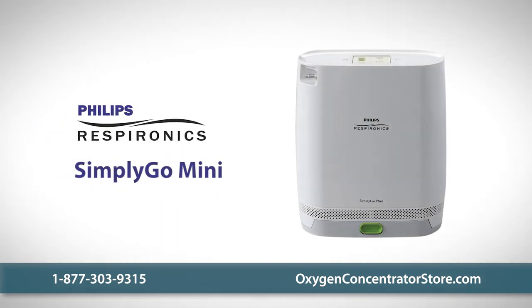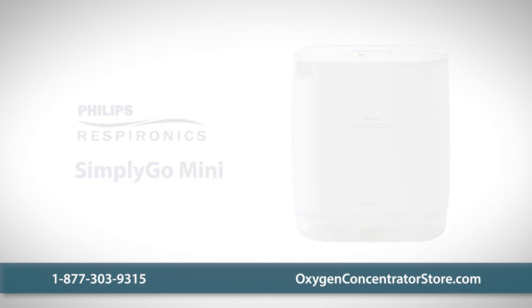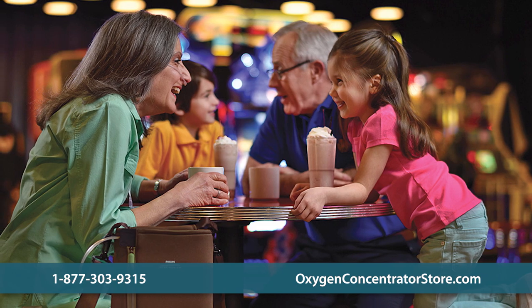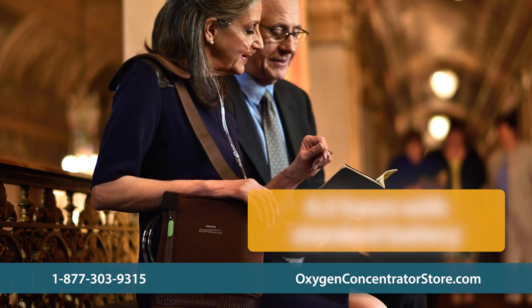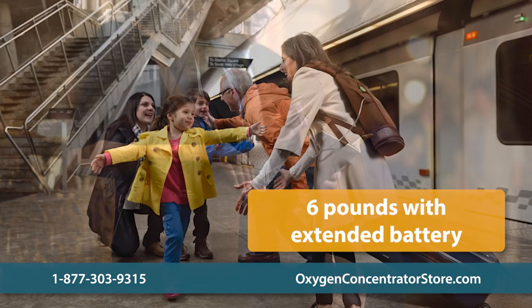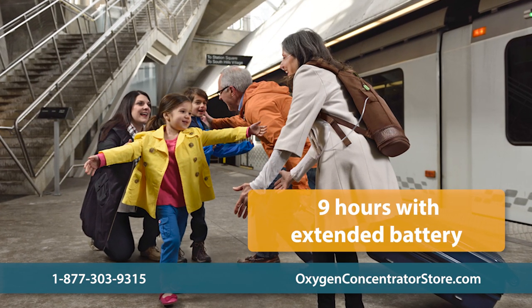The Philips Respironics Simply Go Mini is the next step in innovation in mobile oxygen therapy. This unit makes it possible to stay active and on-the-go while still getting the oxygen therapy you need. The unit with the standard battery weighs only five pounds and provides up to four and a half hours of battery life on a setting of two. With the extended battery, it weighs six pounds and provides up to nine hours of life on the same setting of two.